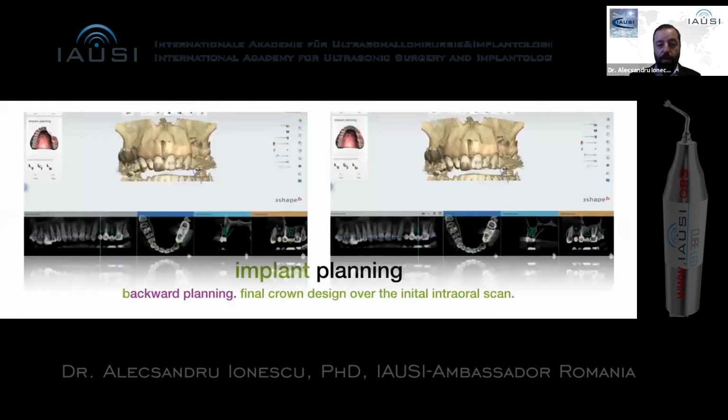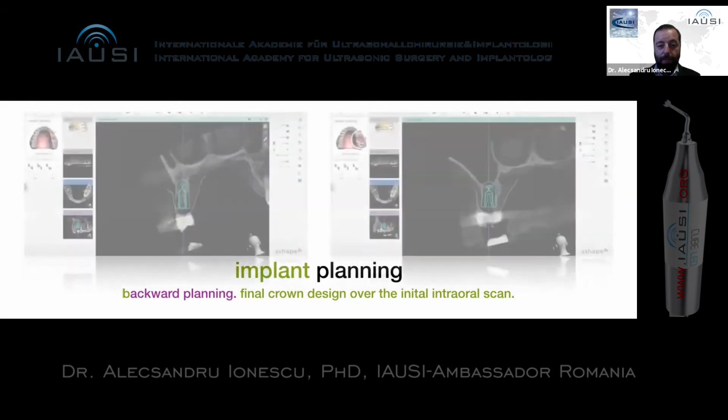So we analyzed, and of course we were able to do a surgical guide, but in this case, with narrow crests, we have the surgical guides for the implant positioning, but we do the bone splitting before, because otherwise, if we just go with a bur through the guide before the splitting, it's going to go outside the crest, because the crest is still too narrow.